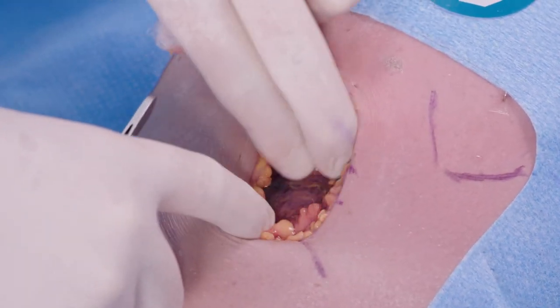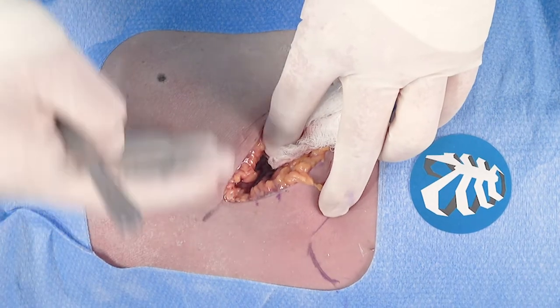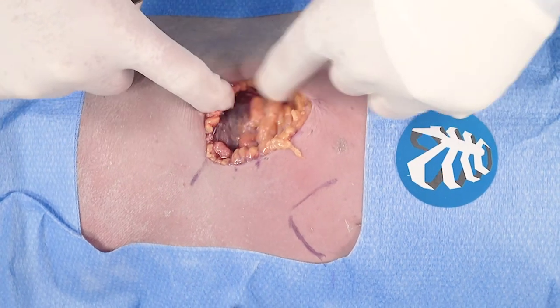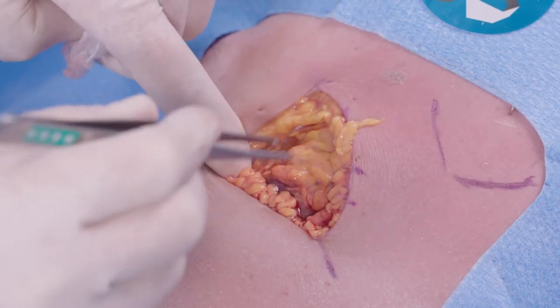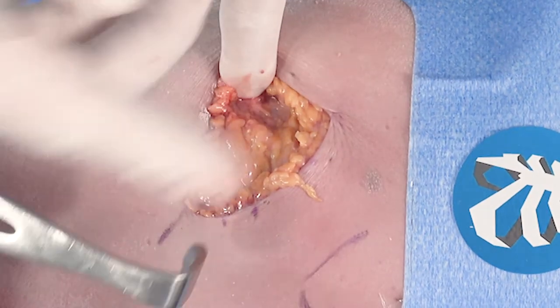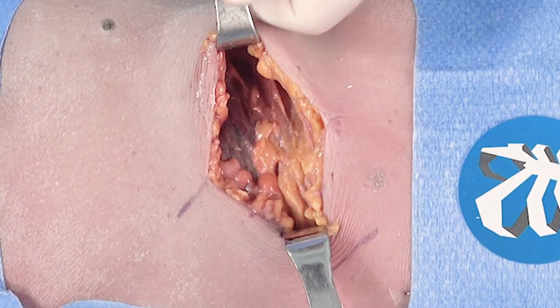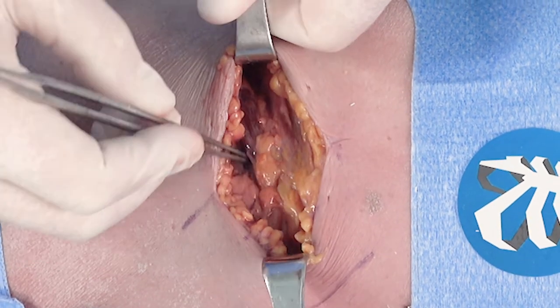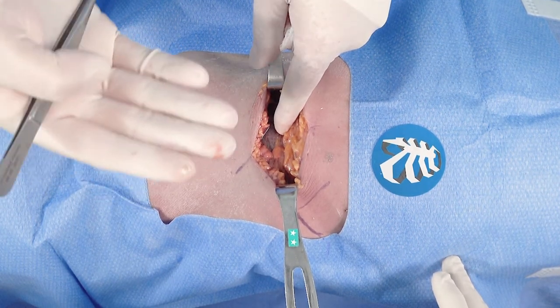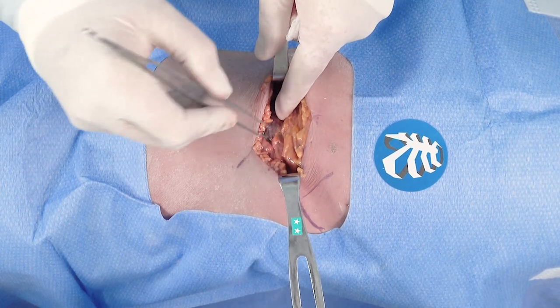Once we've got the skin flaps identified, there are two approaches. One is to anticipate the anterior border of the latissimus dorsi muscle. The other approach is if your fractures are not amenable to elevating and posteriorizing the latissimus dorsi muscle, you may just split the fibers along their direction. You can identify that direction, split them, and there's a submuscular plane underneath the lat that will allow you to elevate it off the chest wall and give you unbridled exposure to the bony elements beneath.